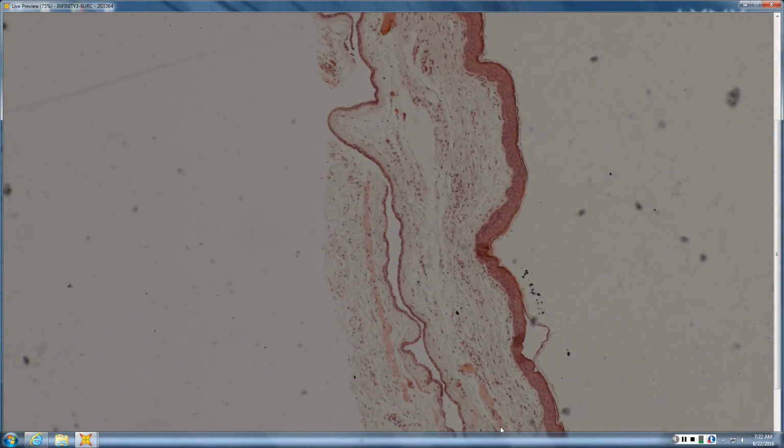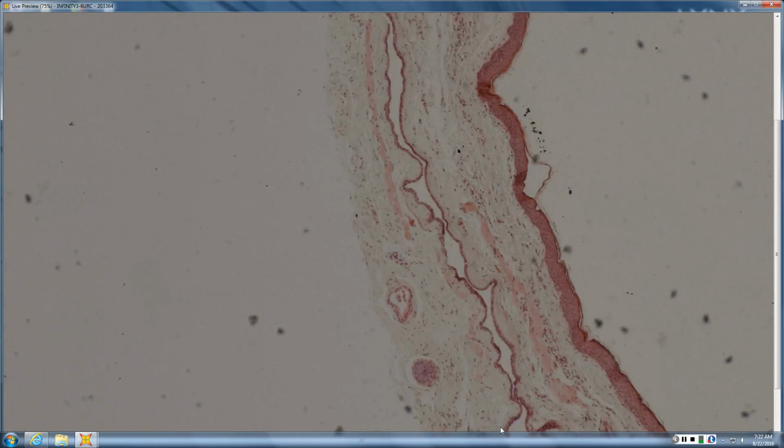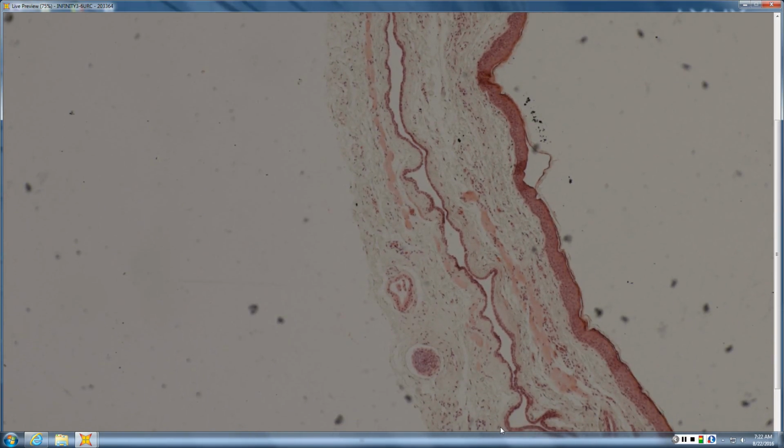If you see more papillary fronding within this, then there's a different term that we like to use called apocrine cystadenoma. And it is important for you to at least vaguely know that there are some things around the eyelid that can start out looking like this. You might think, oh, this is maybe just an apocrine cystadenoma because it's a hydrocystoma with some papillary fronding. But then it looks bad, and there's mucin and whatnot.